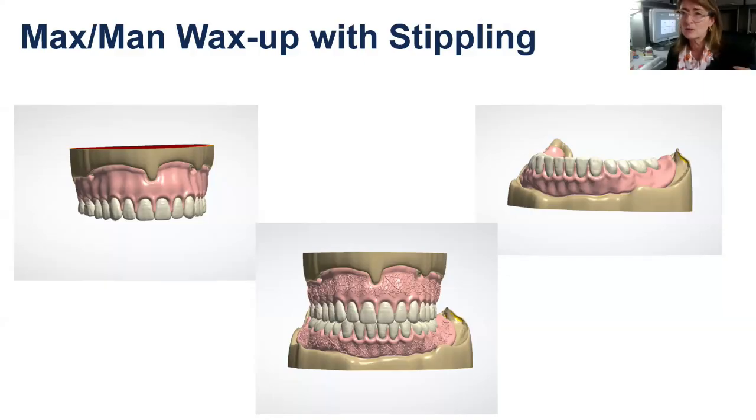And if it's a patient that hasn't worn a denture in ages, but is fully edentulous, I tend to lean towards smooth. I was chairside with a delivery not long ago, and the patient was thrilled. The fit was fantastic. She's smiling in the mirror. She's smiling at all of us. She loved the looks of it. She's chewing and talking and is super, super happy. And then she sits back for a moment, and I see her run her tongue across her teeth. I was like, oh, it's stippled and festooned.